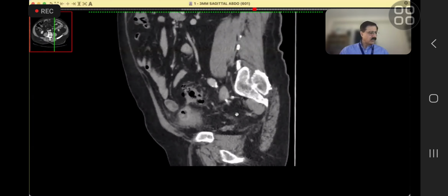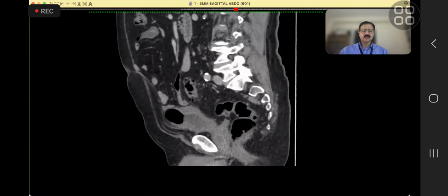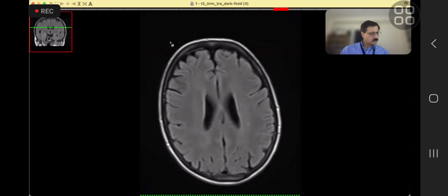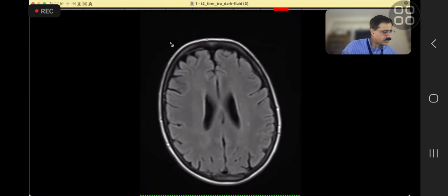Okay, candidate one, thank you very much. Thank you, Dr. Khan. Candidate two, are you with us? Sure, doctor. Okay, this case is a 43-year-old male with fever and headache, and they are worried about encephalitis, question mark. That's the clinical.